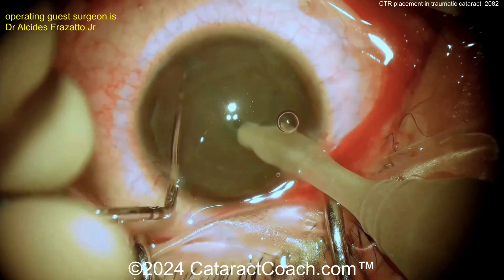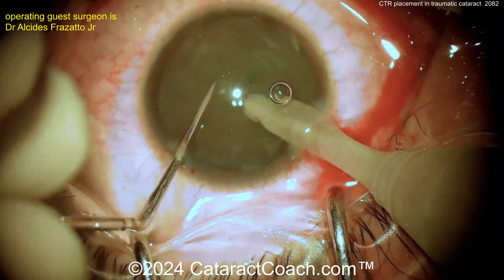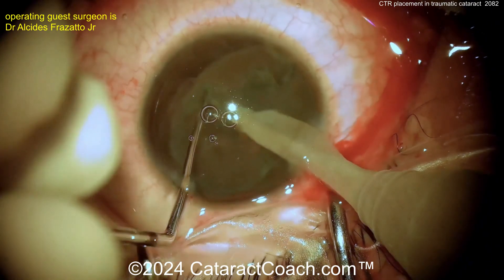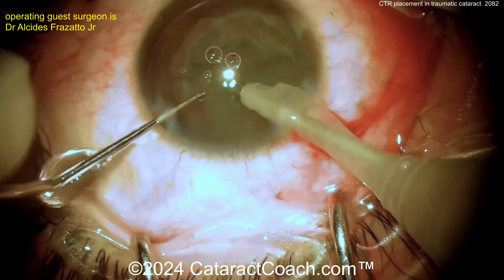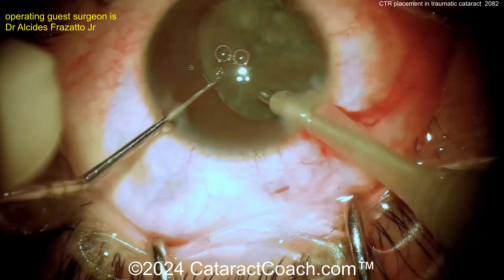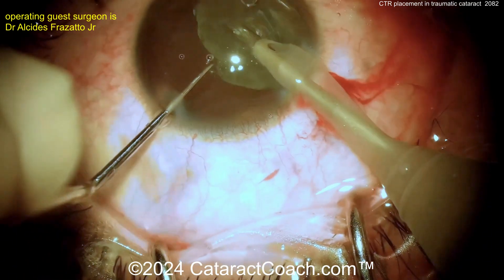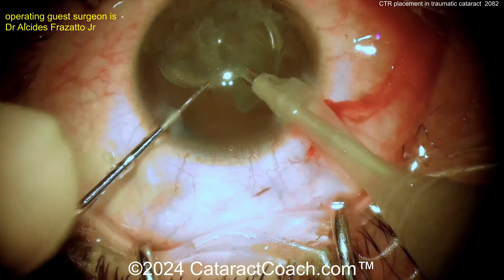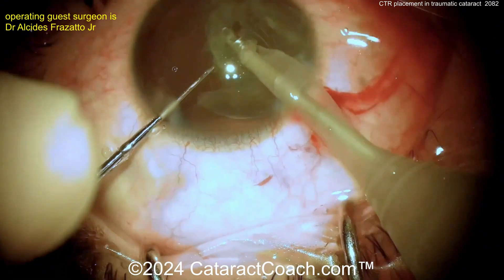The question is where's the iris — is this a traumatic mydriasis or just a patient who dilates really well, or was there some other issue? Chopping up the cataract and taking this out should be pretty straightforward. I'm just keeping an eye on that CTR — I want to make sure it doesn't move much, because that's a good indication of where the capsular bag equator is, which delineates it for you.